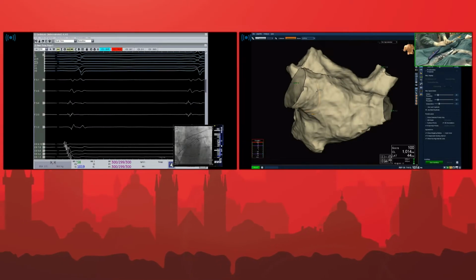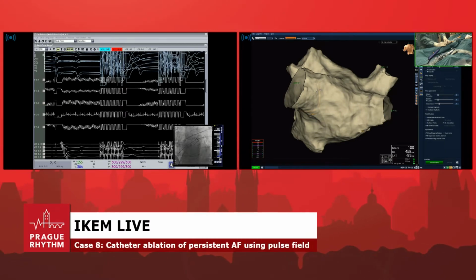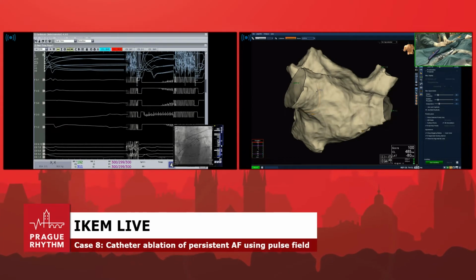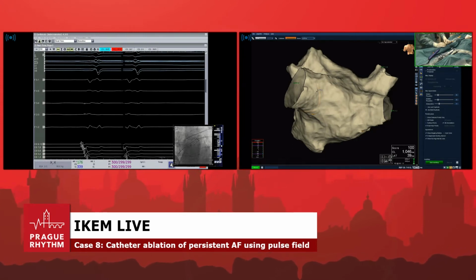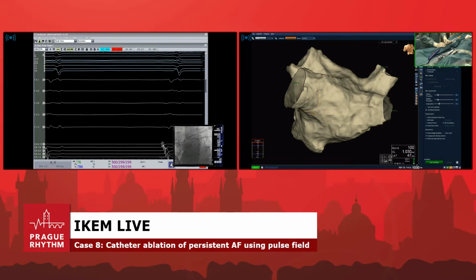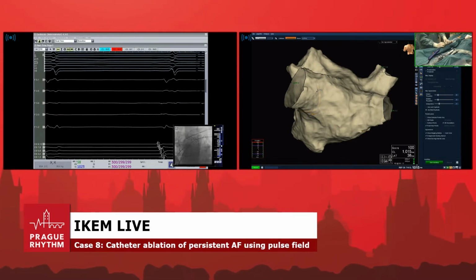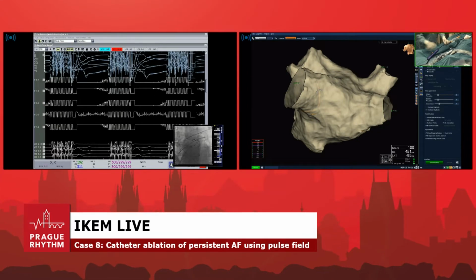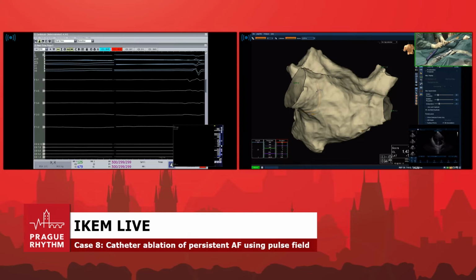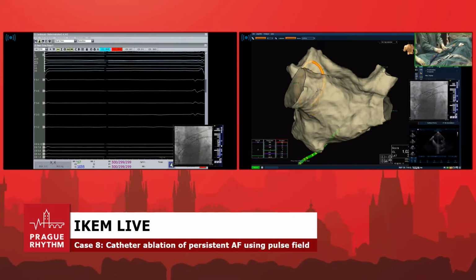LSPV, pulse 1, confirm, deliver. LSPV, pulse 2, go. LSPV, pulse 2, confirm, deliver. Good. Predrag, please hold the wire. Okay, LSPV, pulse 3.